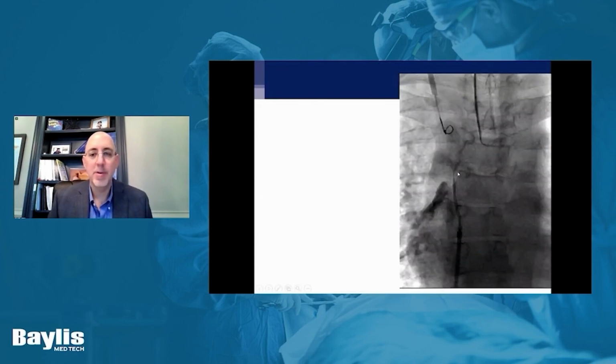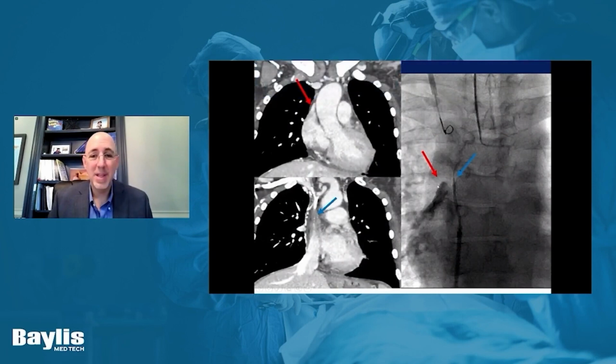Here's a patient with a central occlusion. I think this is really where CT matters. You can see there's one stump here, but my wire is trying to recanalize a brachiocephalic vein. So why wouldn't I go through this stump? Isn't this part of it? Well, no, that's actually the right atrial appendage, whereas that is the central venous occlusion in the blue arrow. So again, if you burn through the right atrial appendage, that's clearly potentially catastrophic. And so meticulous triangulation technique and really good attention to three-dimensional CT multiplanar formats, correlating those to your angiographic images, I think are really essential for success in this procedure.